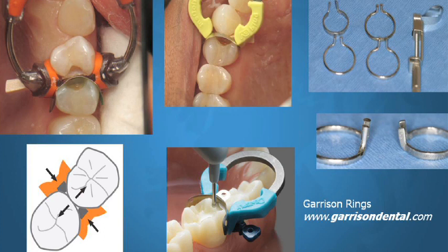It seems to adapt the band a little bit nicer, but the Dentsply, Paladent brand, all of those seem to do. The V-ring is now being sold by Ultradent. Those are very good as well. So you can choose. It's your decision. But any of those work really good.